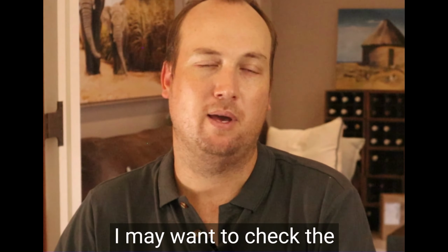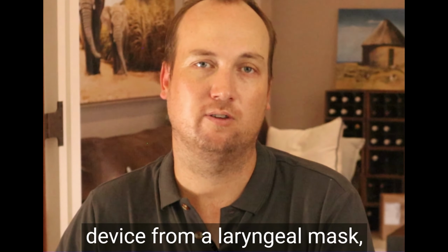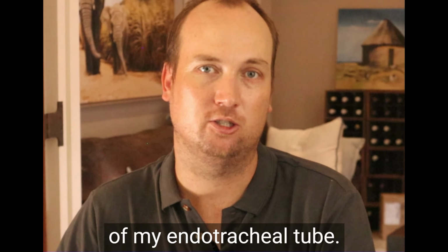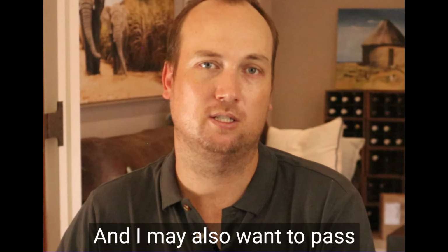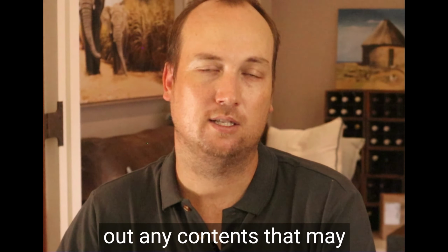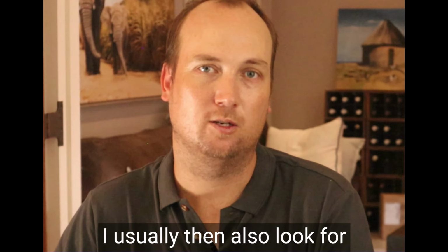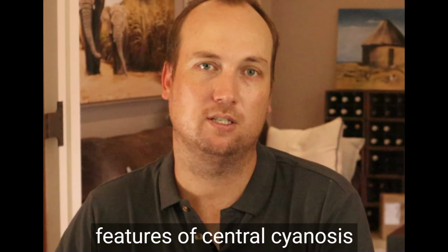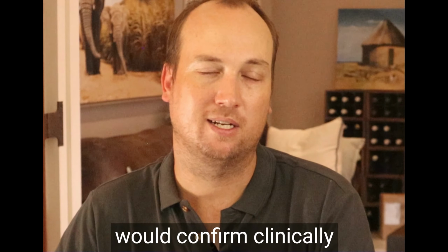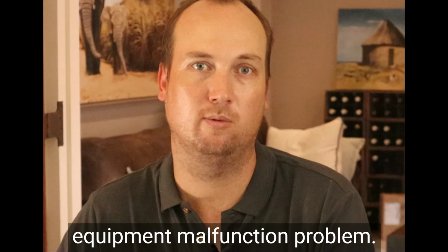Based on these findings, I may want to check the patency of my airway. I may want to change my airway device from a laryngeal mask airway to an endotracheal tube. I may want to check the depth of my endotracheal tube, and I may also want to pass a suction catheter down the endotracheal tube to suction out any contents that may be present and to check the patency of the endotracheal tube. I usually then also look for features of central cyanosis such as a blue tinge to the tongue or the lips, which would confirm clinically that the patient is actually hypoxemic and that it's not an equipment malfunction problem.